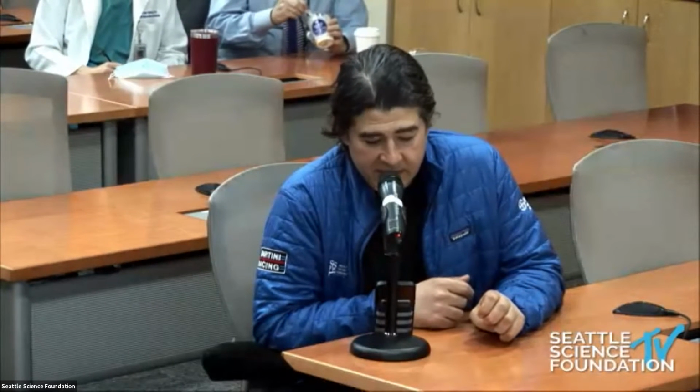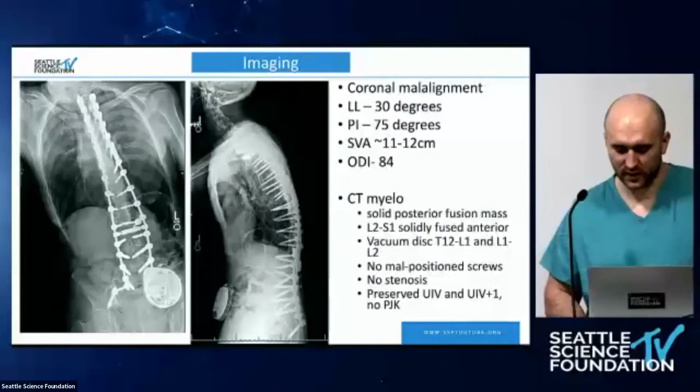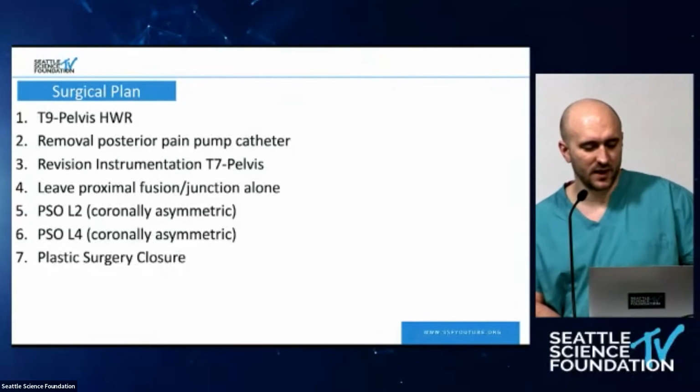Yeah, so I think these are the full-length x-rays we got. Unfortunately, we're not as advanced as you guys, Dr. Sardar. We're working on getting the EOS, but I think that's the future, to get full length, look at the legs, look at the hips. It's funny that you mentioned the full length for looking at the legs, because that'll come into play later.